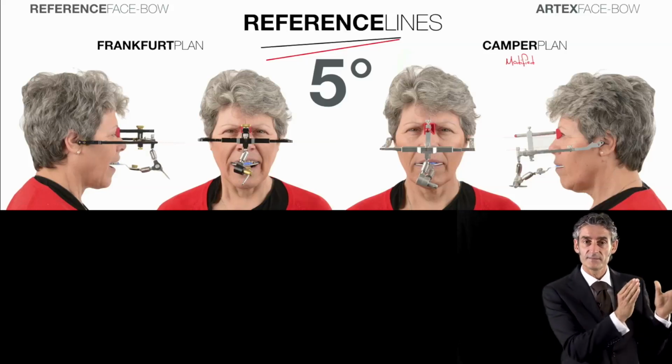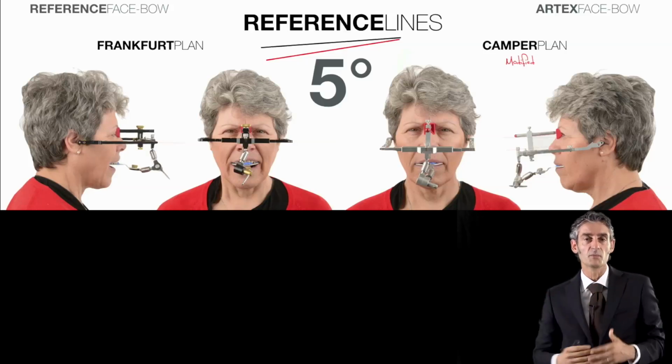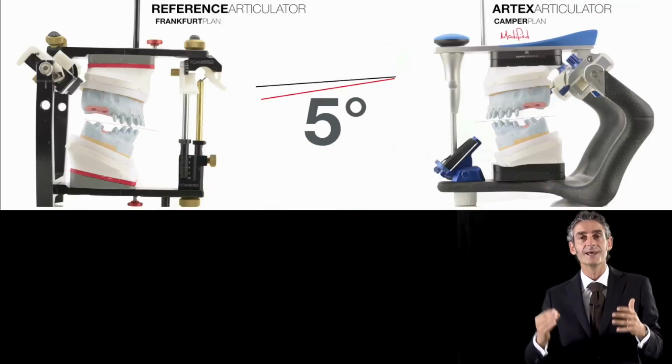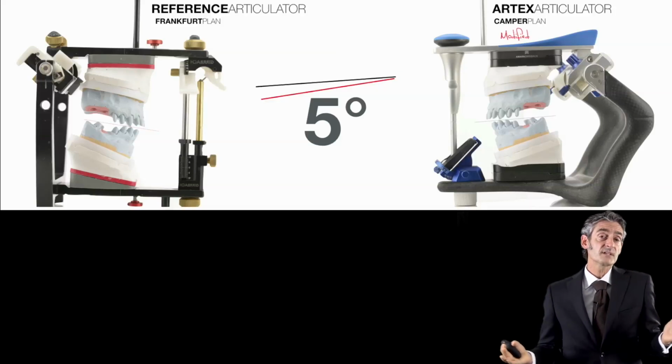As you can see, if it's Frankfurt oriented, we have a position. If it's Camper oriented or a modified Camper oriented position, we have another position. And you can see that the inclination of the cast inside the articulator is different, by at least 5 degrees.